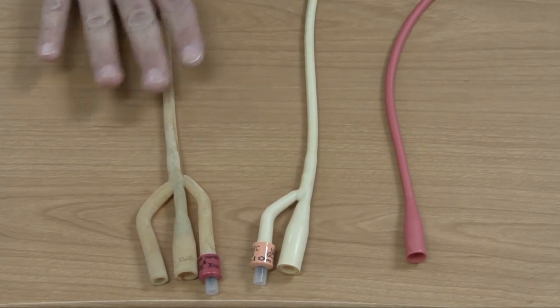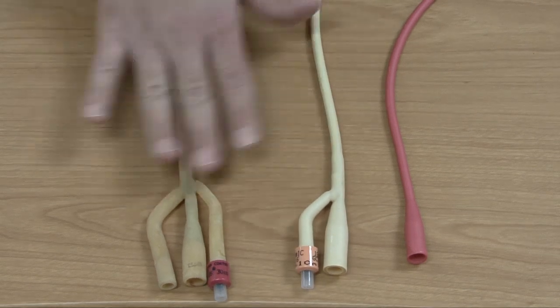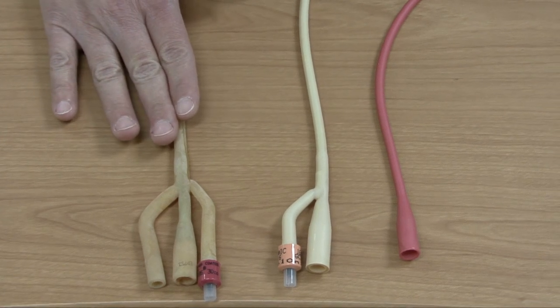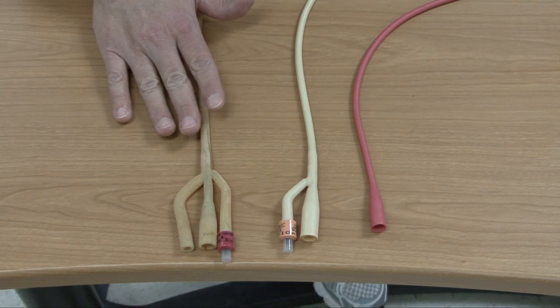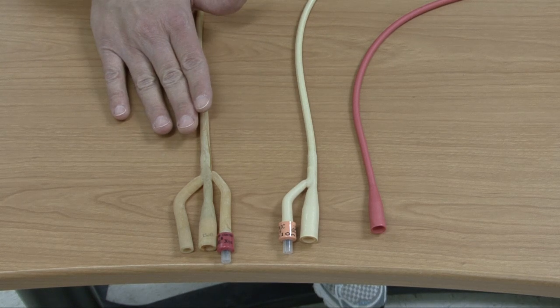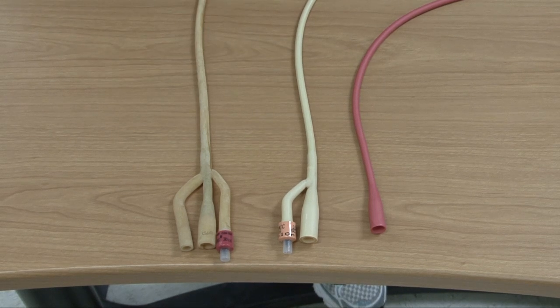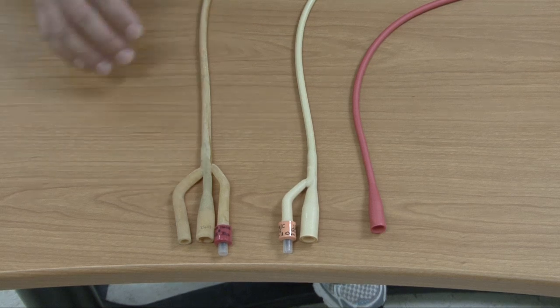We've talked about different types and sizes of catheters. Another thing to note is these catheters are all latex, so you need to make sure your patient is not allergic to latex before you use them. If your patient is allergic to latex, they do have special catheters that are silicone or Teflon. Also, you're usually going to clean your patient with betadine, so always ask if they're allergic to betadine as well, as you might have to use another cleansing agent.